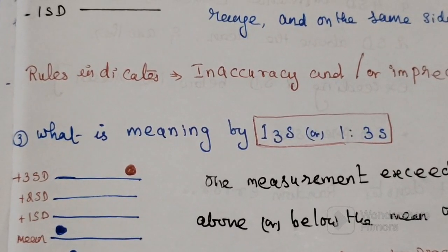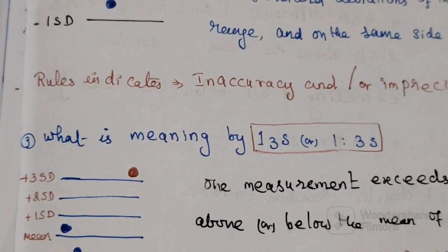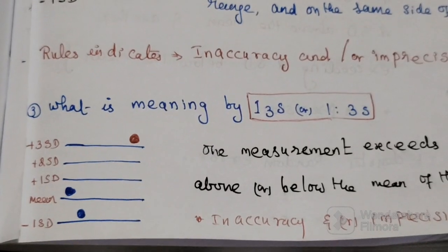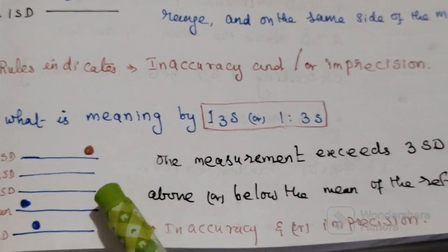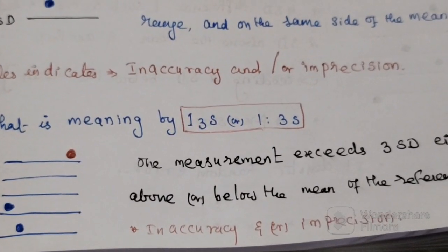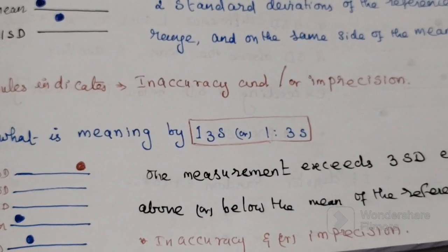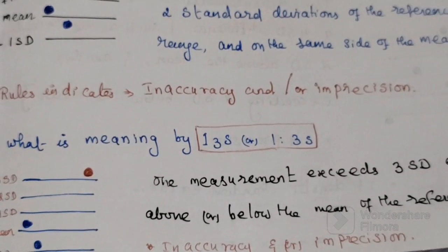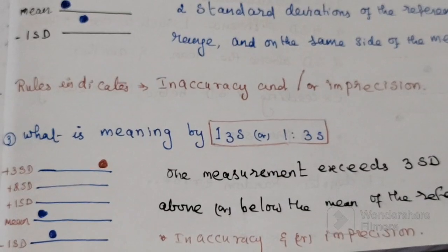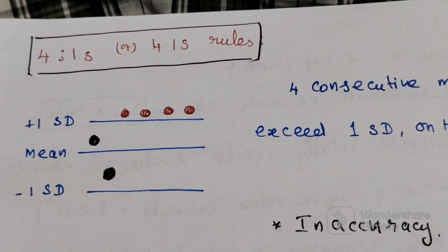Next one is the 1 3s rule. What is the meaning of 1 3s? Here you see that the fifth control measurement, one data point, is above 3 standard deviation. That's why it is called the 1 3s rule. It denotes random error or the beginning of a large systematic error. This is definitely a rejection rule, and we have to reject our run and troubleshoot the cause of random error or large systematic error, and only after corrective action can patient samples be processed.